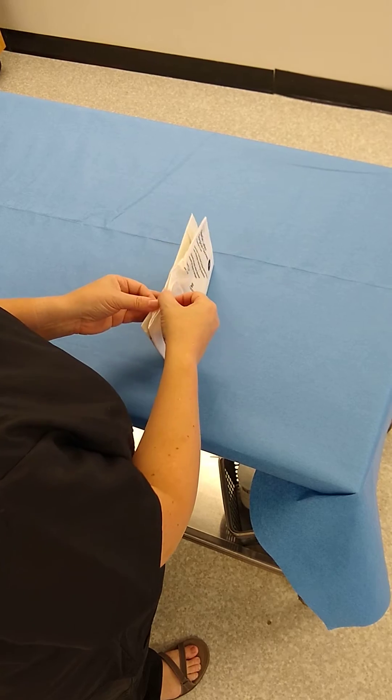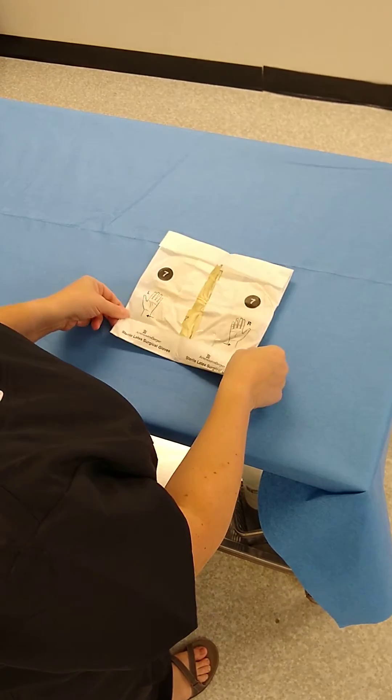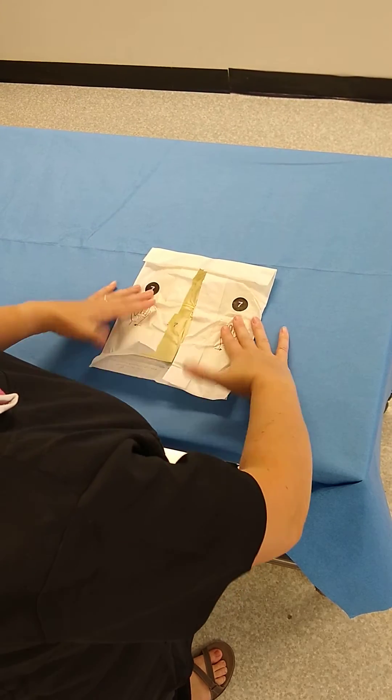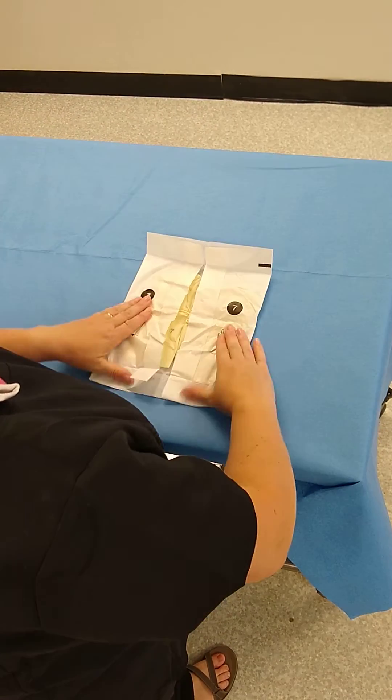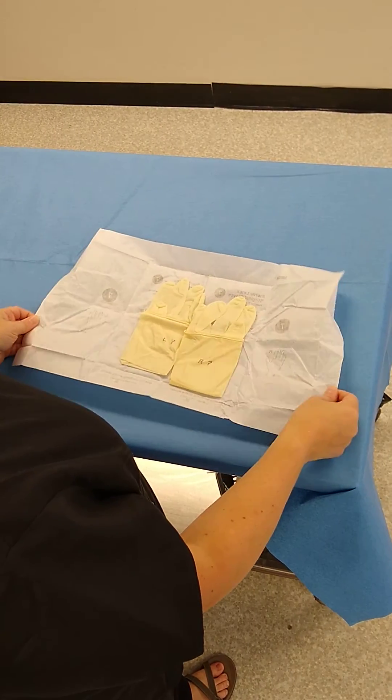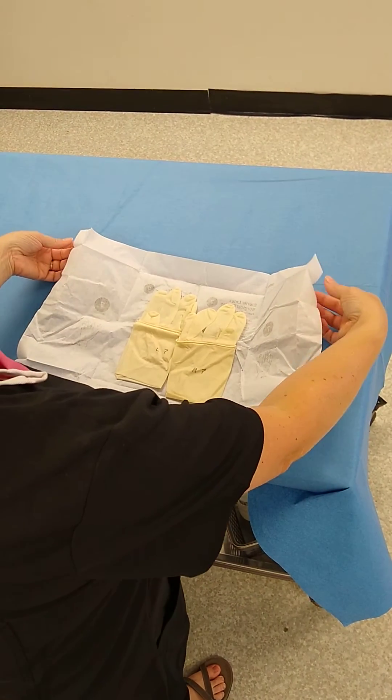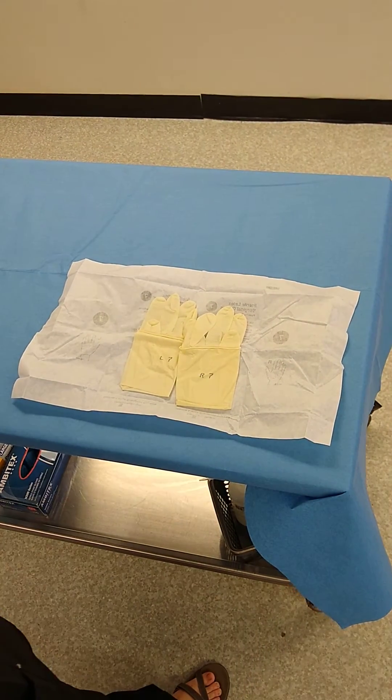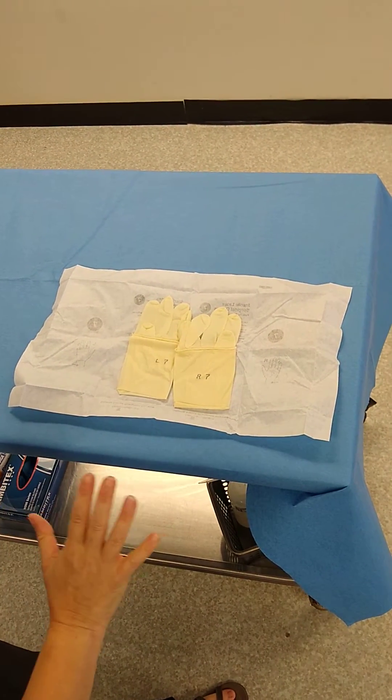Unfold. Unfold this way. Notice I'm staying away from the sterile field. Bring the tabs out and straighten them off a little bit. Now I've got my gloves open and ready to set aside.